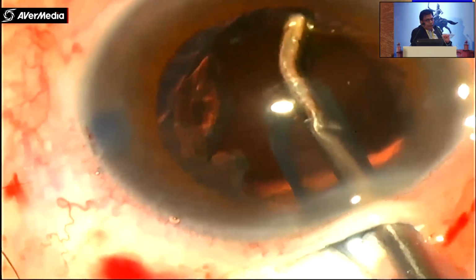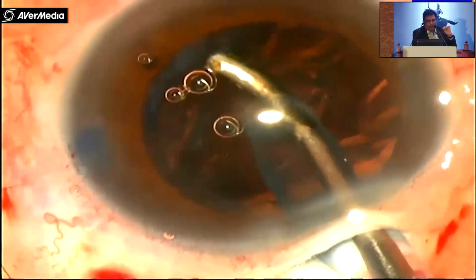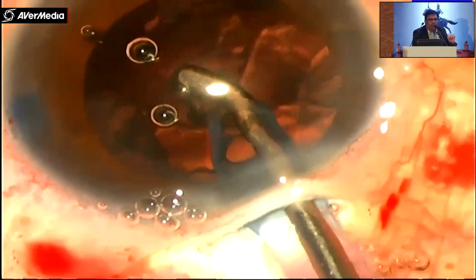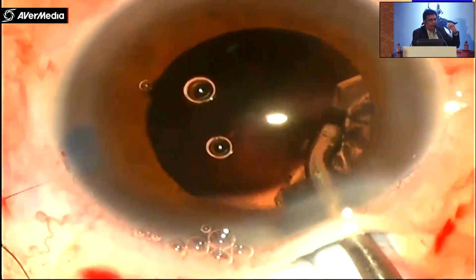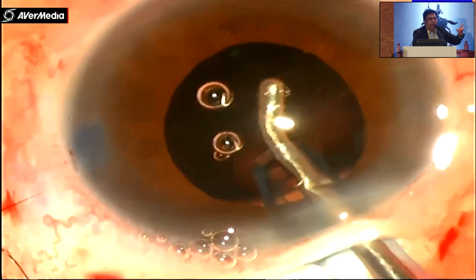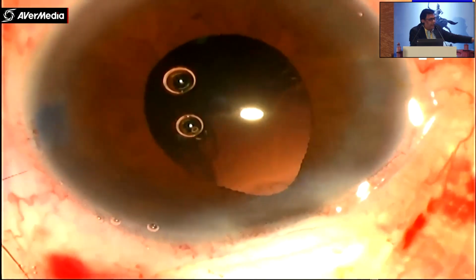Not only in phaco, when you are doing irrigation aspiration also, this primary position is very, very important. Just now Rohit sir mentioned the floppy iris. A normal iris can turn out to be floppy because of this position. You can see the iris, suddenly the iris came out like this.